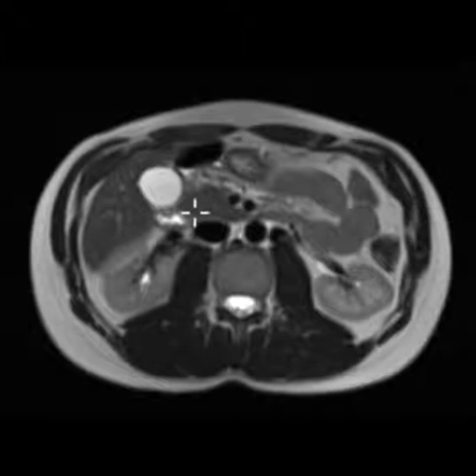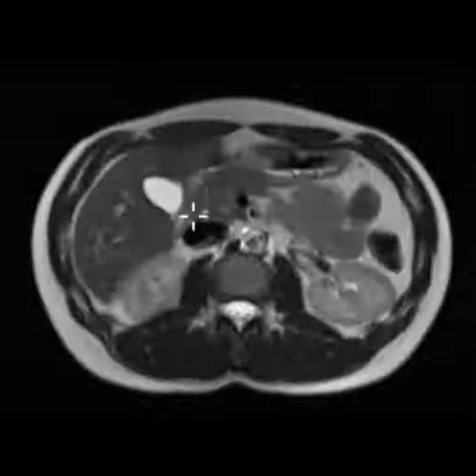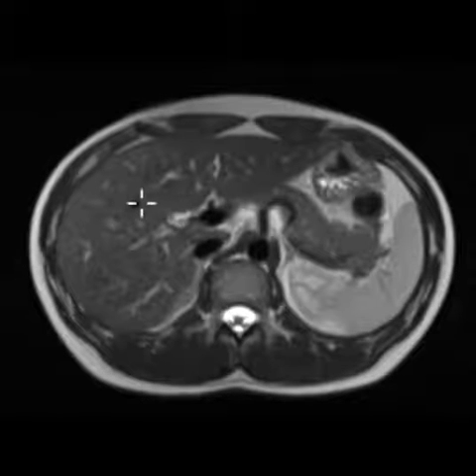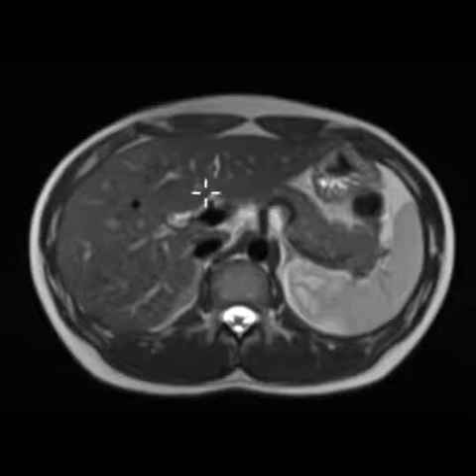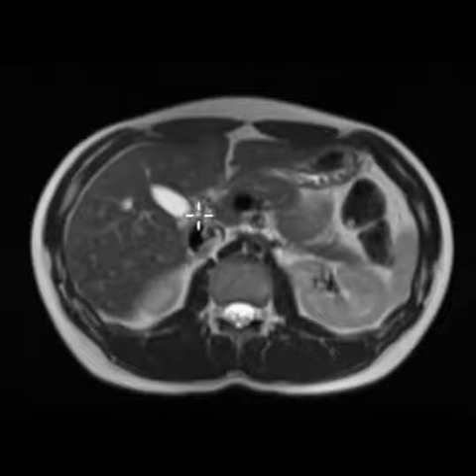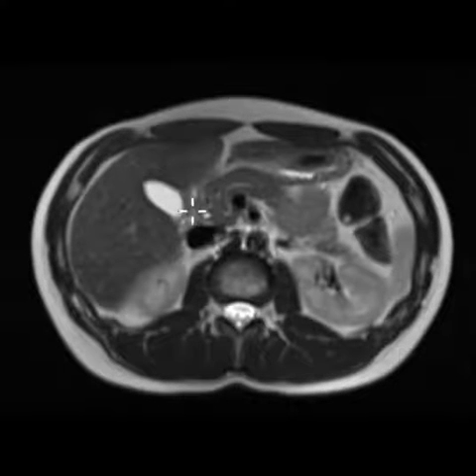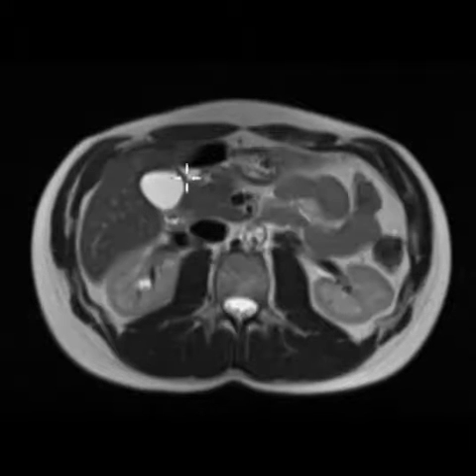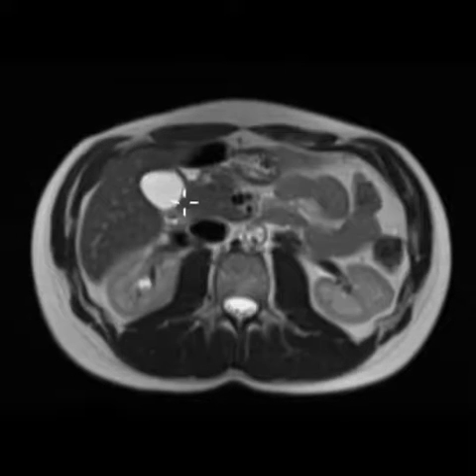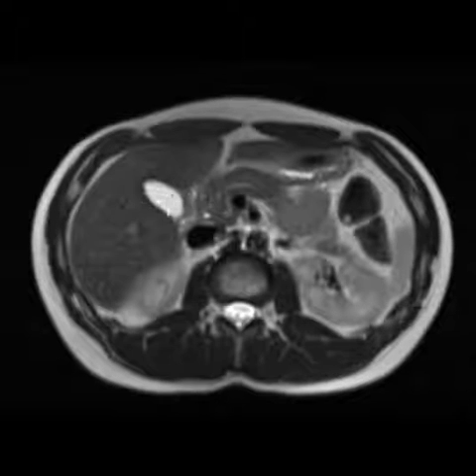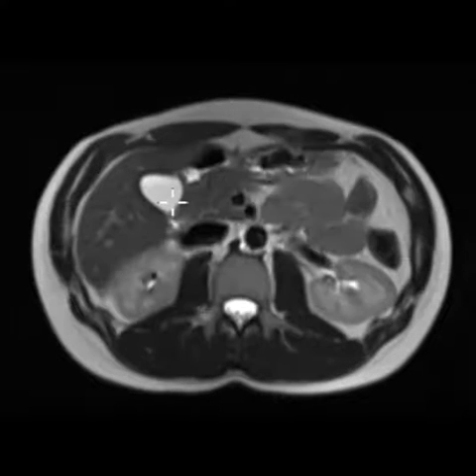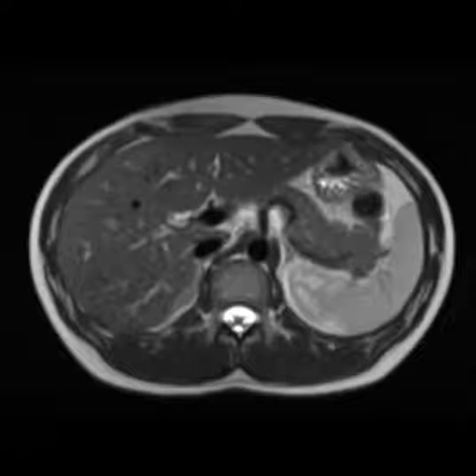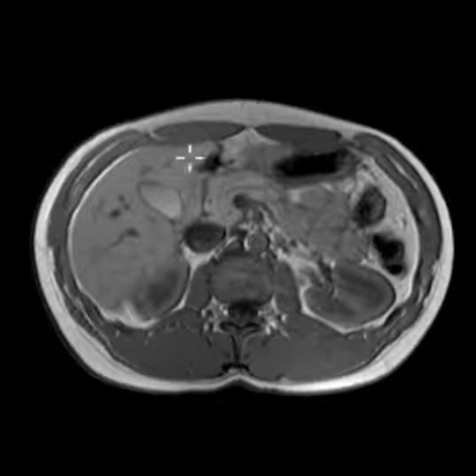We look to see: is the bile duct dilated? Is there a stone or stricture causing obstruction? Is there a mass in the pancreas obstructing the common bile duct? We also look at the ducts in the liver — there's no dilatation here. But if they were dilated we'd see a tube coming out of the right or left lobes, or both, and we may also see a dilated common bile duct. The gallbladder looks normal here — no wall thickening. When the wall is thicker and inflamed, we call that cholecystitis, and when we see those little round filling defects, we call those gallstones.